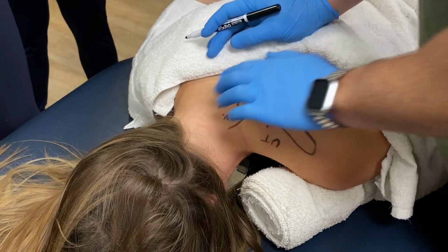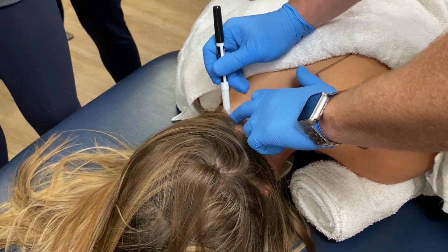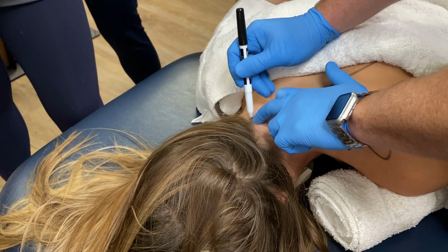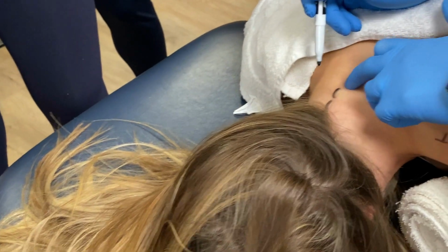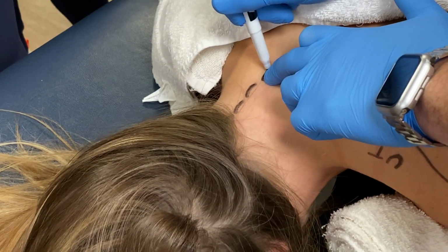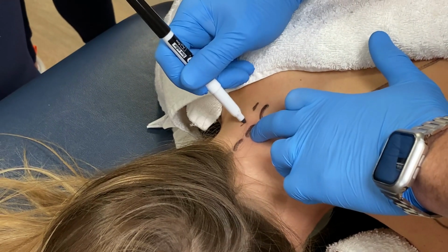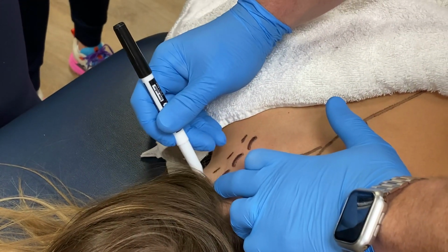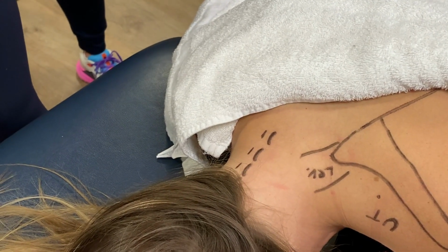Now, for the cervical paravertebrals, we're going to find the spinous process, and we're going to find the edge of the spinous process. We'll mark the edge of the spinous process. Then we're going to mark 1 finger width out from the edge of the spinous process using the patient's finger width, not yours. After those markings are complete, you'll perform the same markings on the opposite side of the neck.